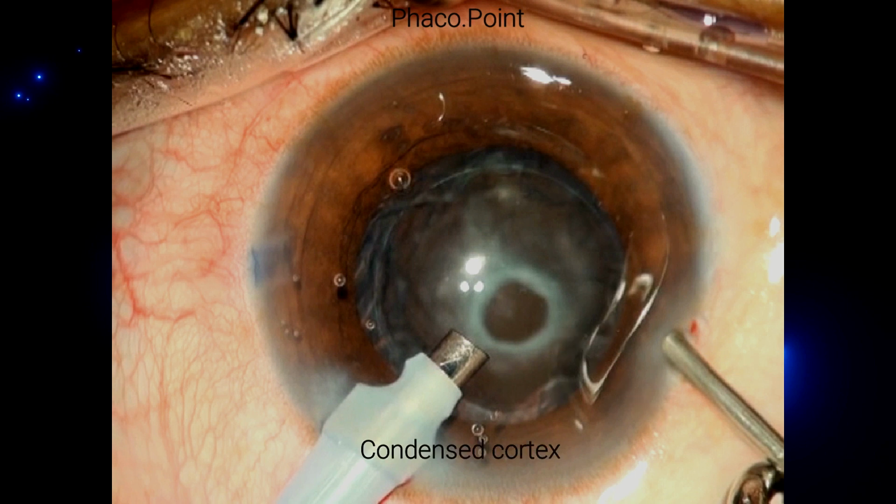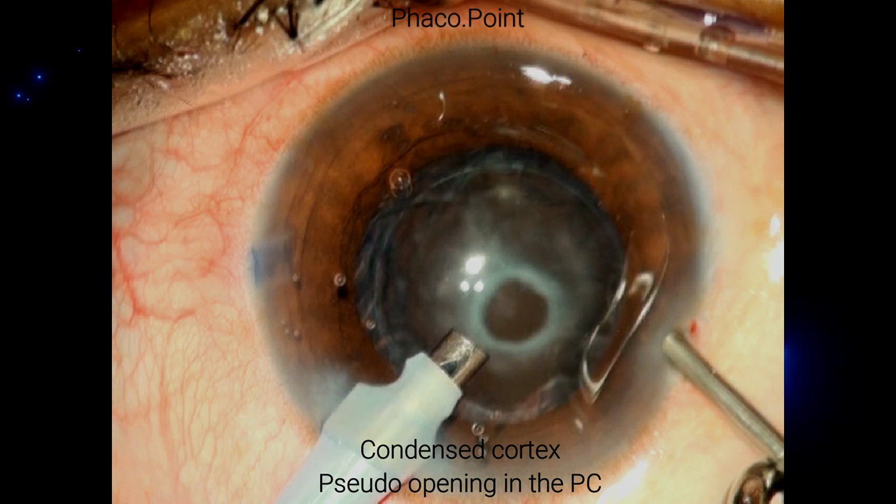Just to enhance your understanding, this is not an opening in the posterior capsule. This is an intact posterior capsule with a mere condensation of the cortex in a circular fashion, which is very typical in a patient with a posterior polar cataract.